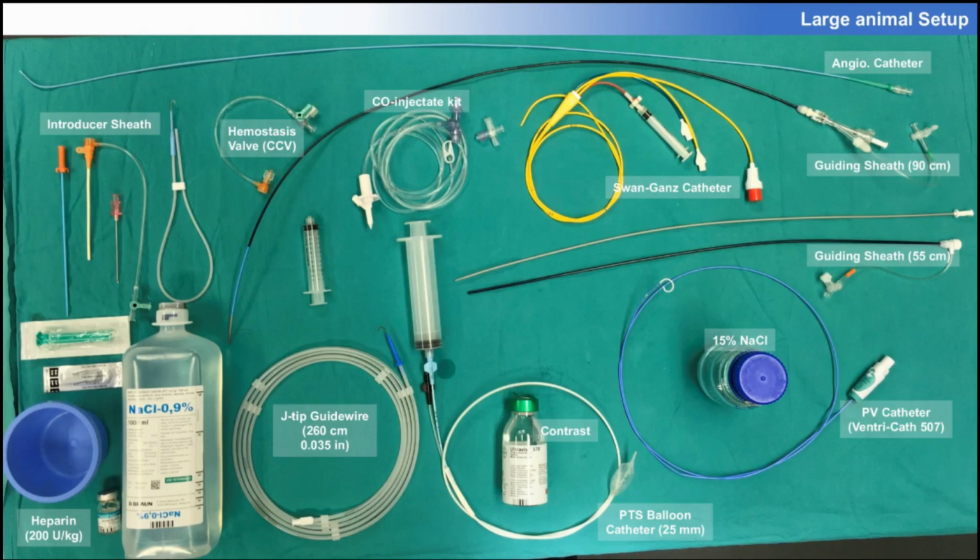Then we have our Swan-Ganz catheter, which is introduced through the jugular vein and allows for measurement of pulmonary artery pressures and cardiac output. And we have our inferior vena cava balloon, which is introduced through a femoral vein and is placed below the right atria to occlude blood return when we need to. Lastly, you have other accessories and drugs, such as heparin, which is required when performing catheterization, contrast that can be used to identify the cardiac anatomy, and hemostasis valves, which are very helpful when using catheters and sheaths in off-label applications.